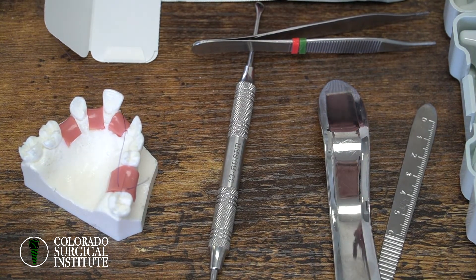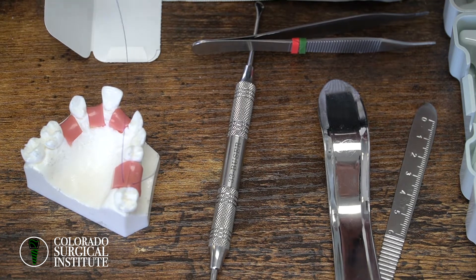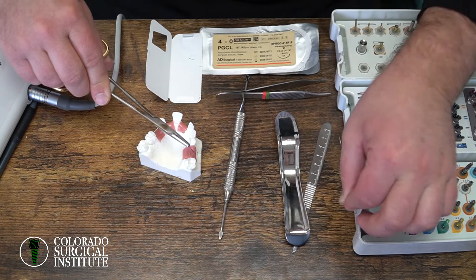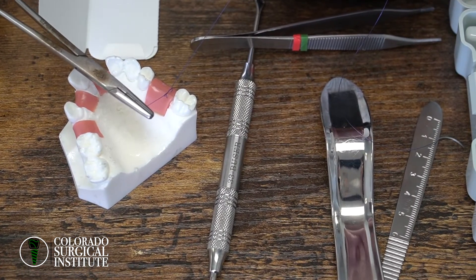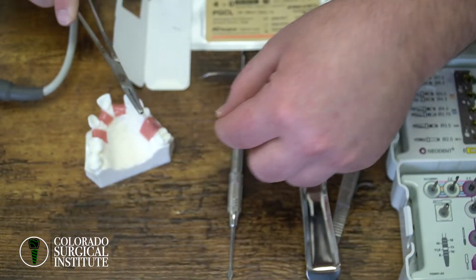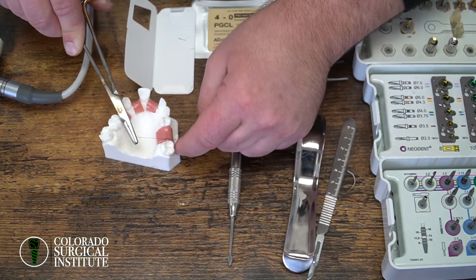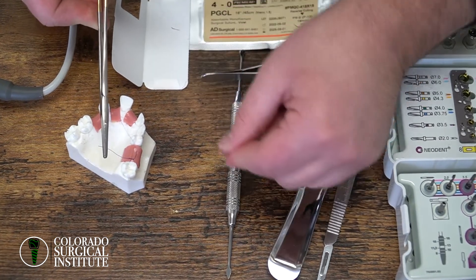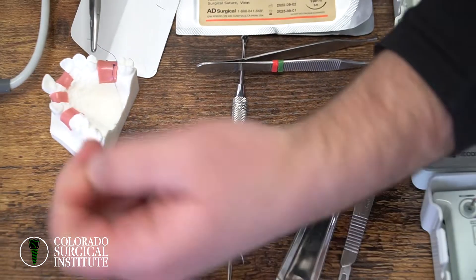I like to pull it through, and you don't want a really long tail because you're just wasting suture and going through another pack unnecessarily. You have the suture up now, with the shorter end on one side — not too long. Then you go two forward, I usually do three on this one. See how the suture wants to get pulled one way? A common mistake is pulling it the wrong direction — if it's twisted when you put it down, it won't hold and it'll loosen up. It's important to make sure you're laying your suture down flat.